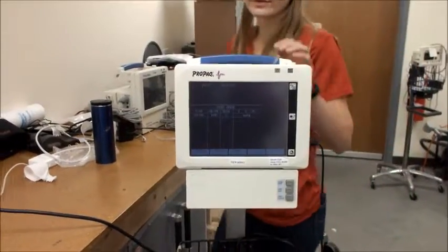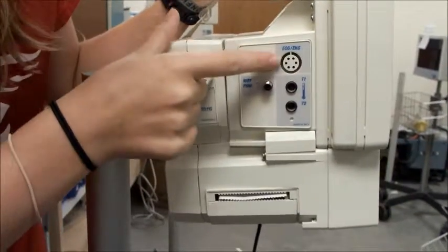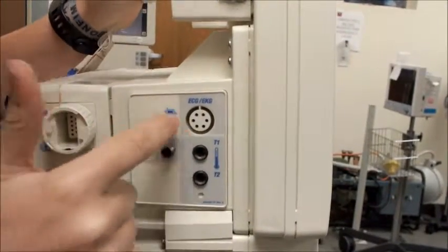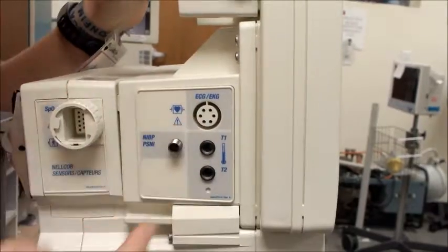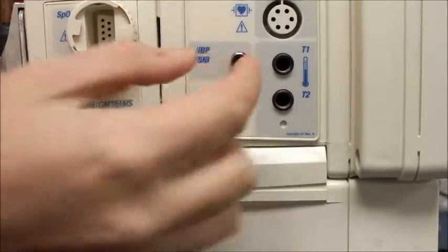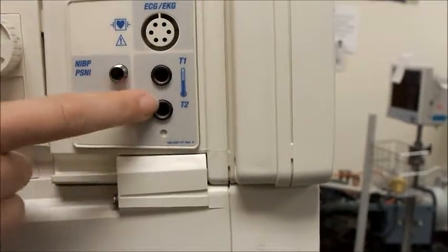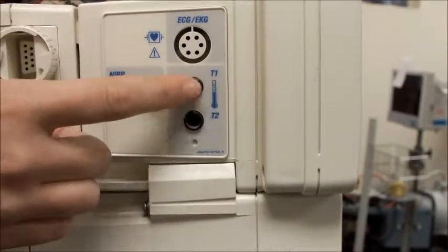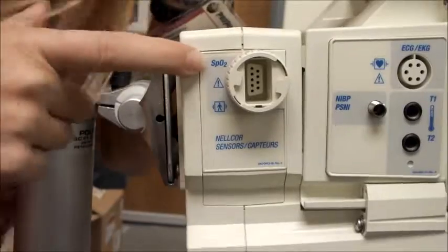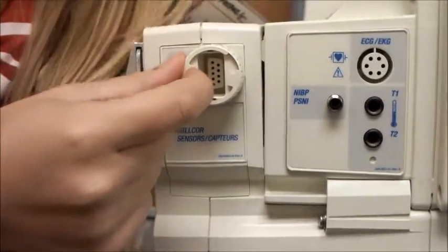The next thing we're going to look for is the different connections on the machine and the kind of cords we'll need for each. Where it says ECG or EKG, that's where we'll be testing the heartbeat of the patient, so we're going to need a cord that has six prongs. Where it says NIBP, that's the blood pressure cuff, so we'll need blood pressure tubing with the correct attachment. Because this machine says T1 and T2, we'll be testing temperature as well, so we need a cord that fits that hole. Where it says SpO2, that's where we'll be testing oxygen, so we need a connection that fits that hole.